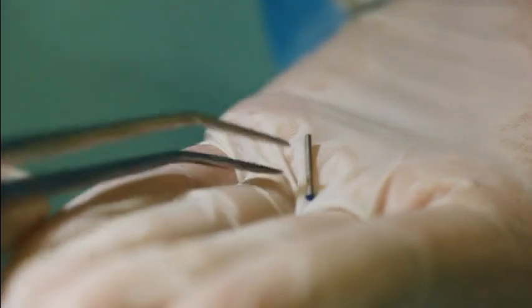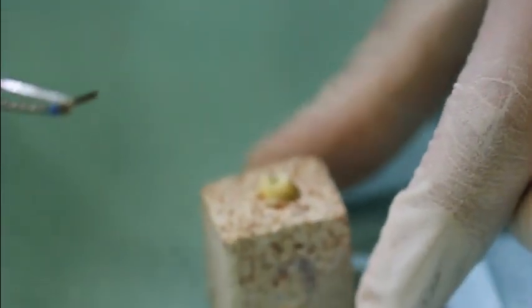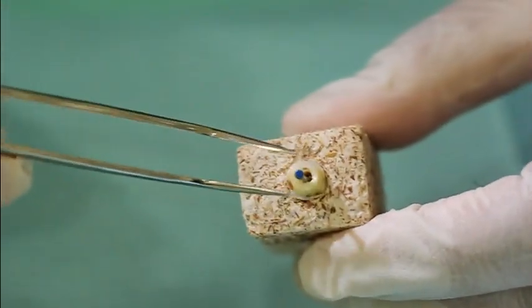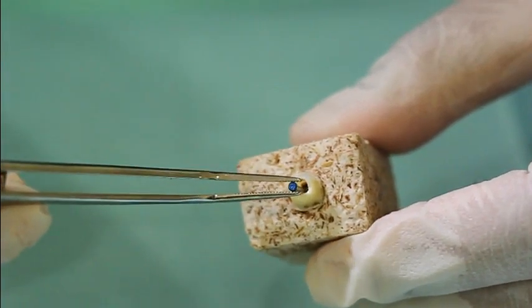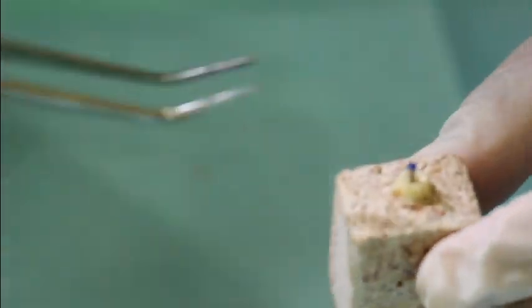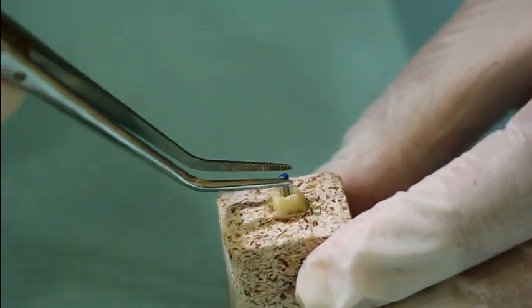Okay, so this is the temporary post from the PARAPOST kit that I showed you before. It is the same size as the impression post and the last drill. Place the post inside the canal, and then check the fitting.